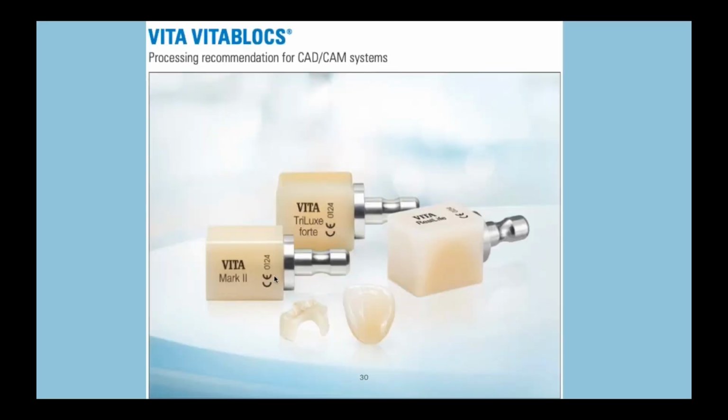So these are what I like to use for some single crowns that I can modify, because I can grind them and put whatever I want, Lumex or VM9 on it, and they work absolutely beautiful.